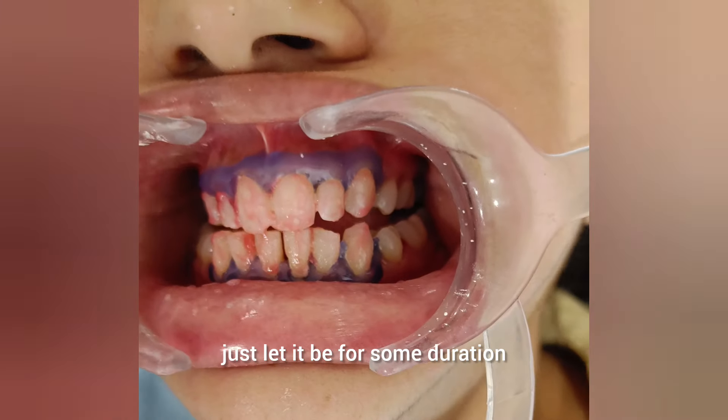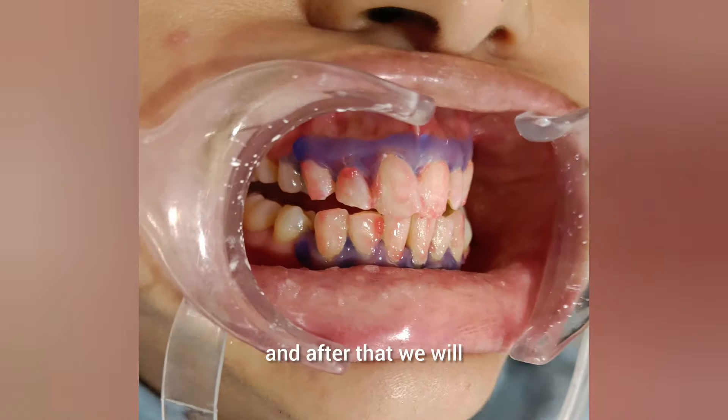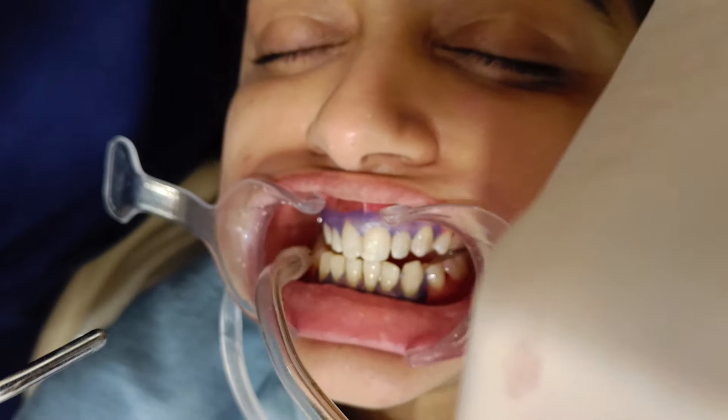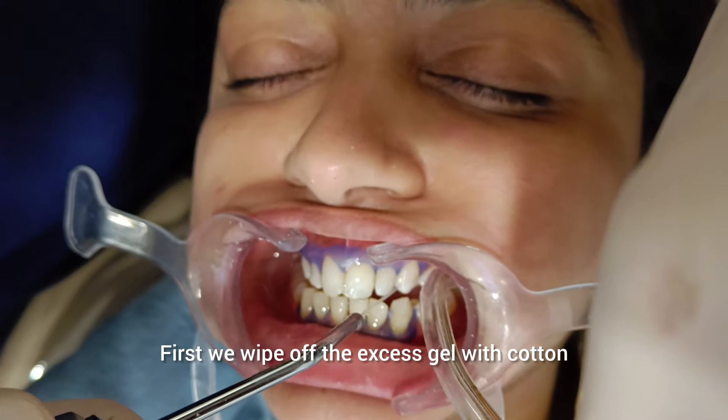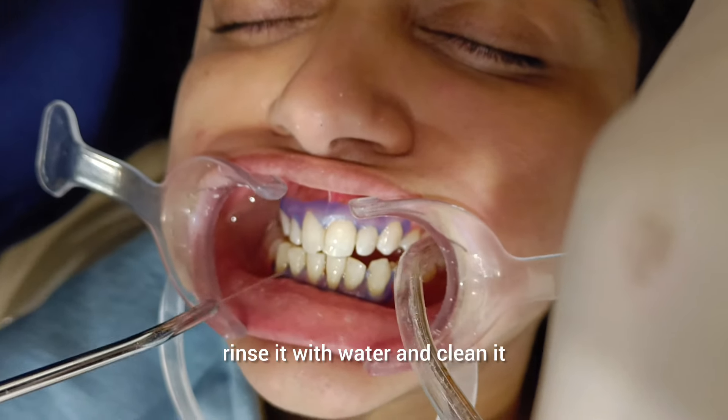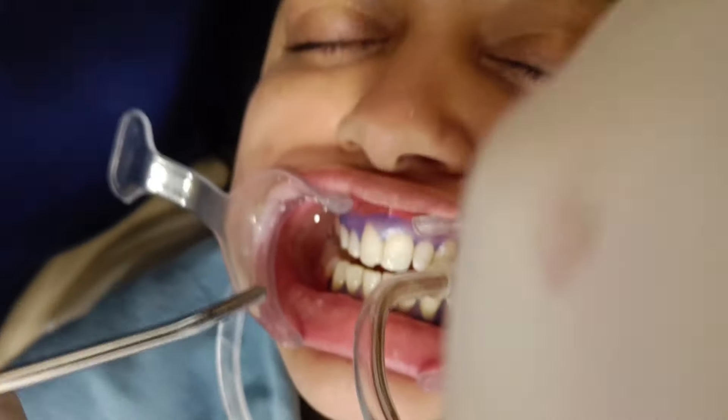Now we will just let it be for some duration, and after that we rinse it with water and clean it with suction.